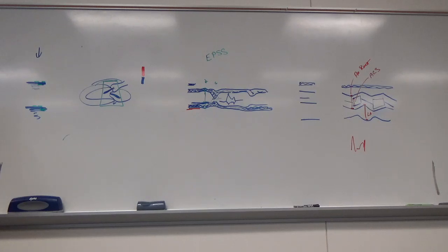For the color Doppler, all we're looking for is just like the flow going through the valves. Correct, and if it's going across the walls. It should not cross the walls. Like if you had a ventricular septal defect, for example, it would show up there, potentially. Or other things that are going on. So you want to throw the color Doppler on as kind of a generalized look at what's going on in this area, to get an idea of what the hemodynamics is really doing.